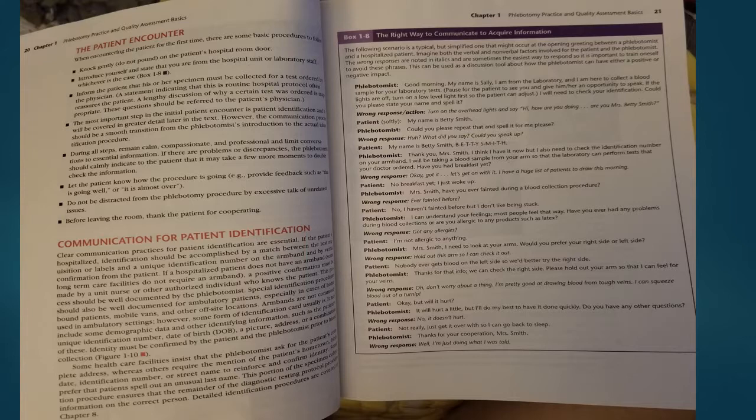Introduce yourself and state that you are from the hospital unit or laboratory staff, whichever is the case. See Box 1.8. Inform the patient that his or her specimen must be collected for a test ordered by the physician. A statement indicating that this is routine hospital protocol often reassures the patient. A lengthy discussion of why certain tests were ordered is inappropriate. These questions should be referred to the patient's physician.